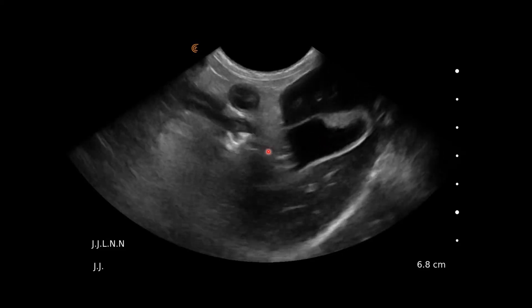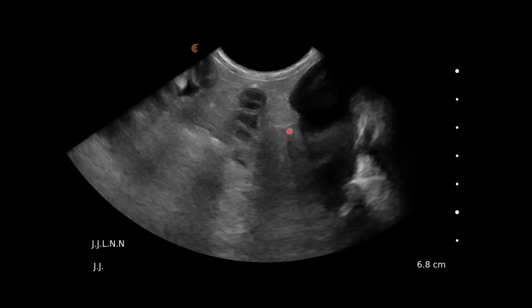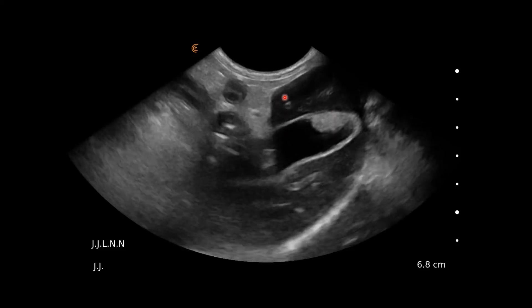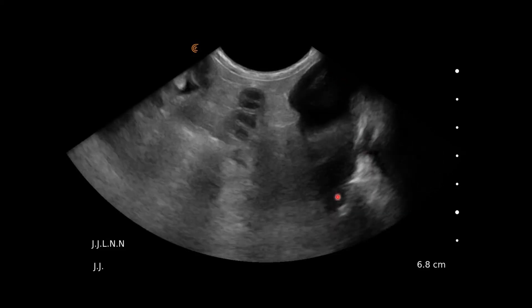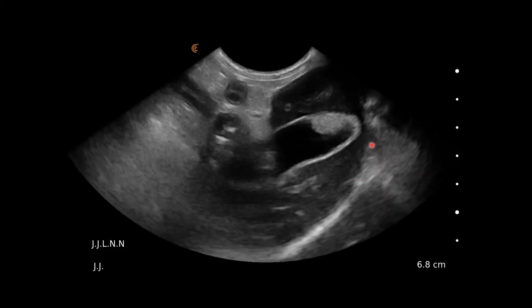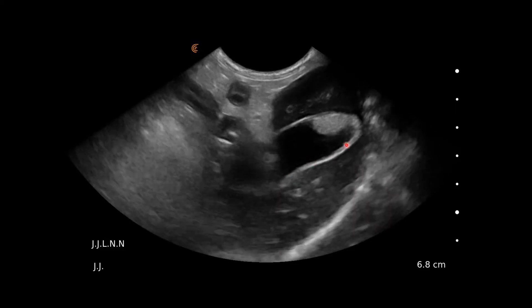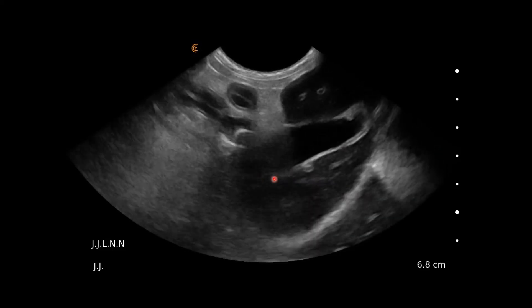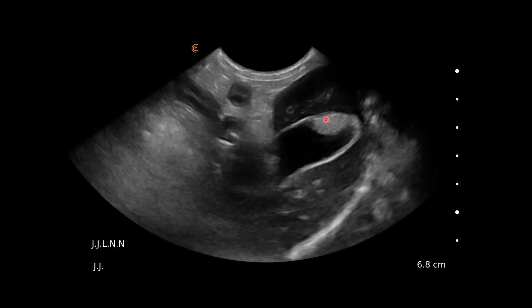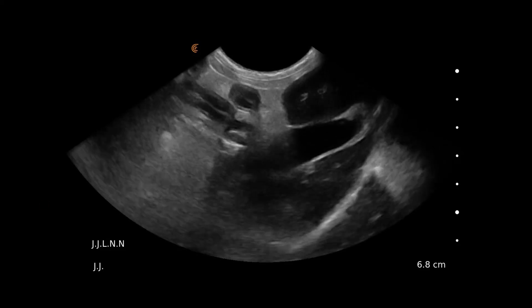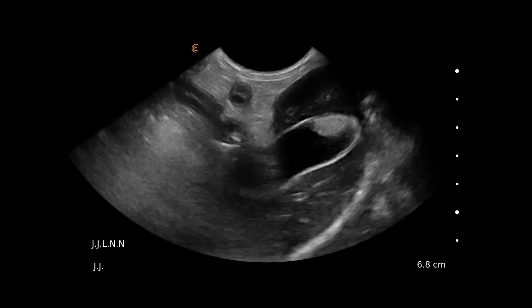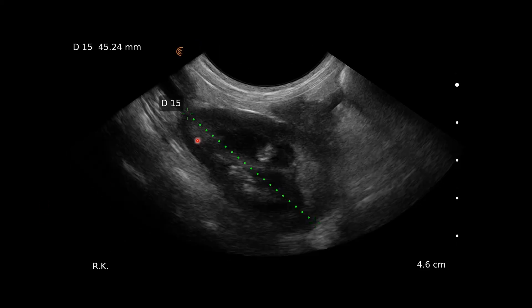The gallbladder wall is quite hyperechoic, but I feel that is due to the liver being so hypoechoic in this case rather than there being a gallbladder abnormality. There appears to be a little bit of sludge in there too. The right kidney is seen here, measuring similar to the other side and looking normal.